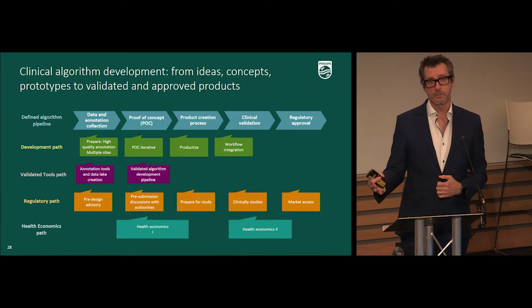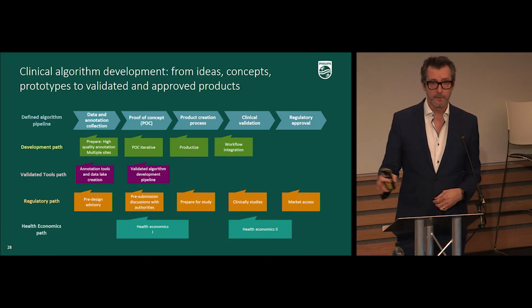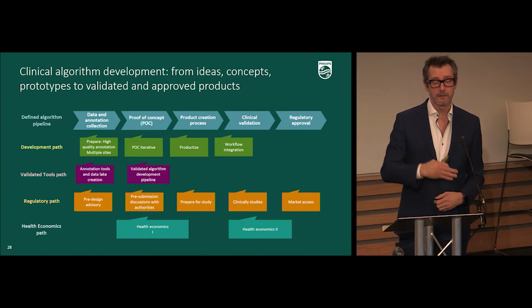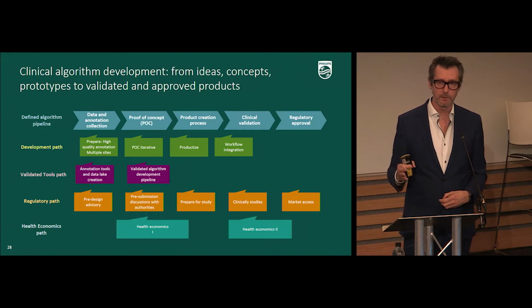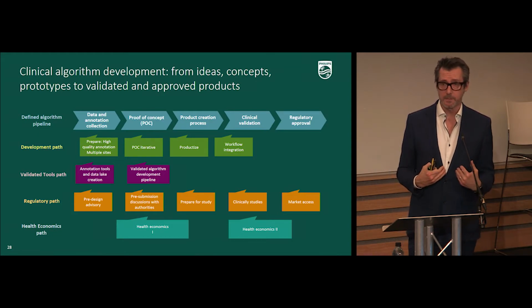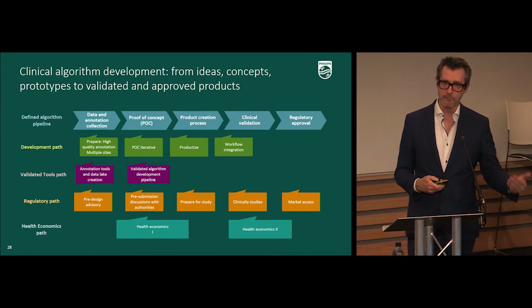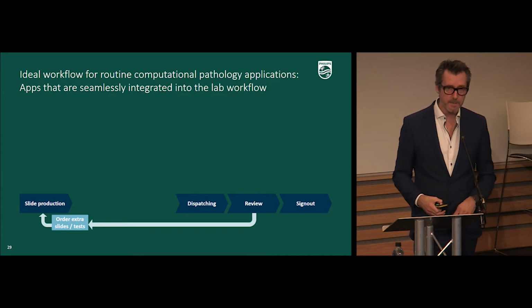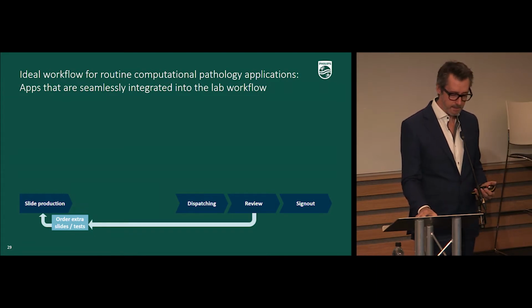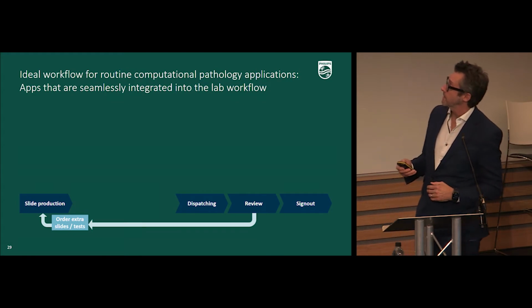Where we can take those to the appropriate regulatory authorities, the FDA, in Europe, to have them CE-IVD cleared, and to have them cleared by regulatory organizations in different parts of the world. And this is our responsibility as an industry lead in this space to ensure that we're delivering safe and reliable algorithms in clinical practice. These algorithms can be defined in a series of ways. I just want to show this in the last few minutes.